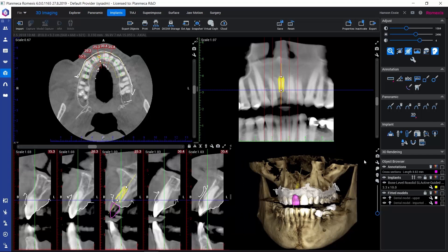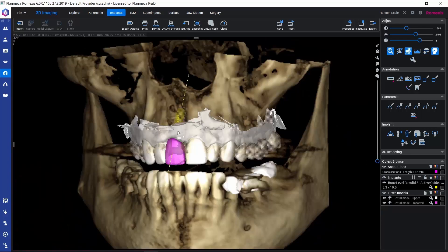We could also reposition the implant using this 3D rendered view. If we select the implant in the object browser, or if it was active already, we could keep our Control and Shift buttons down on the keyboard and grab the implant with our left mouse button and move it around. Also, by keeping Control and Shift down on the keyboard and using our right mouse button, we could rotate the implant. So it would be possible to reposition the implant also here in the 3D rendered view.